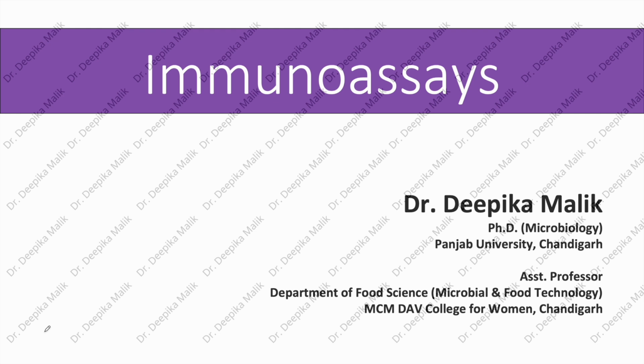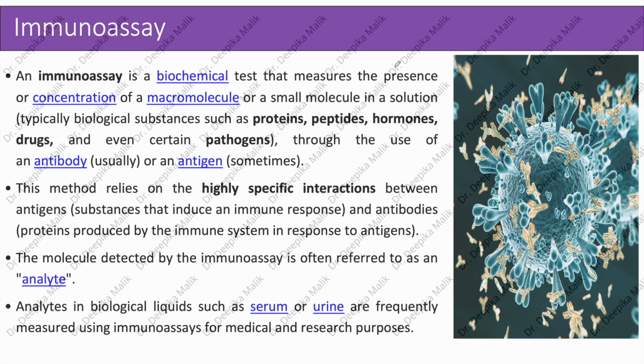I am Dr. Deepika Malik and today we'll be starting with a new topic, that is immunoassays. An immunoassay is a biochemical test that measures the presence or concentration of a macromolecule or a small molecule in a solution, typically biological substances such as proteins, peptides, hormones, drugs, and even certain pathogens, through the use of an antibody usually or an antigen sometimes.